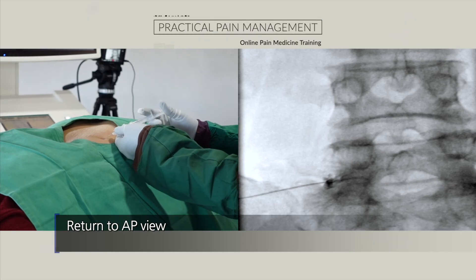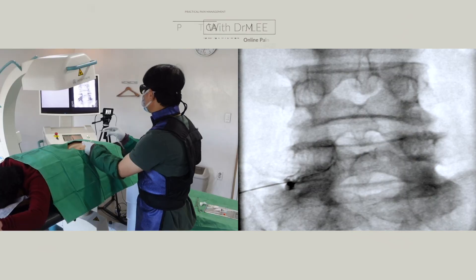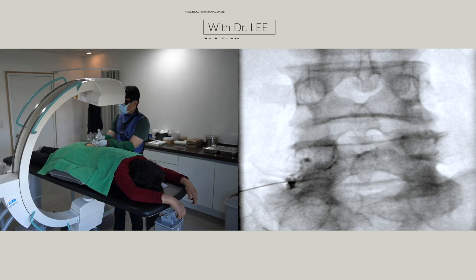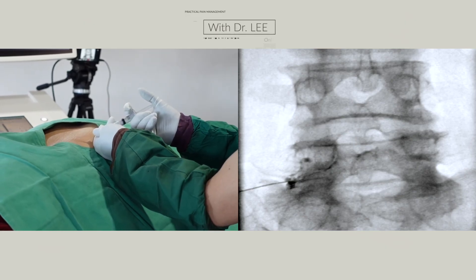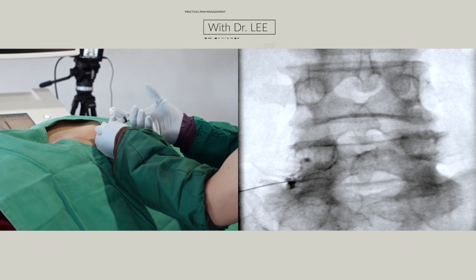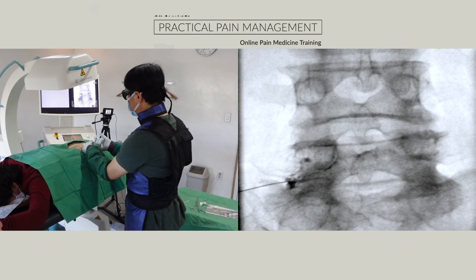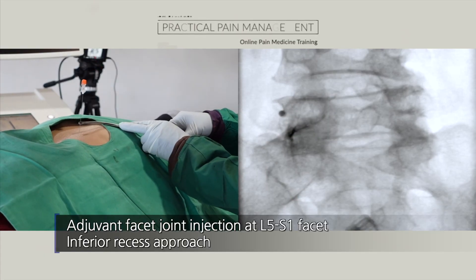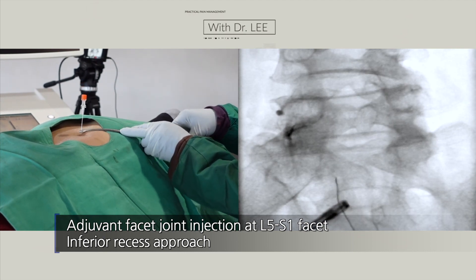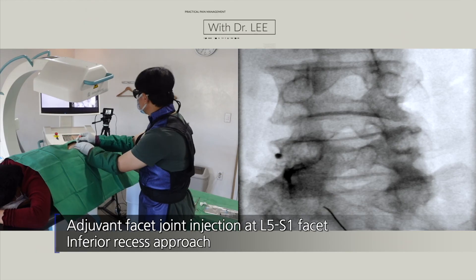I was not satisfied with the contrast pattern, so I selected the facet joint at L5-S1 at the same level because she has foraminal stenosis. I chose the inferior recess approach.